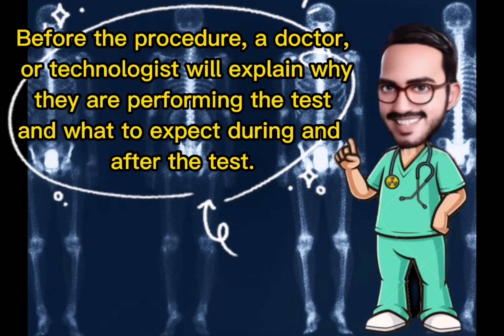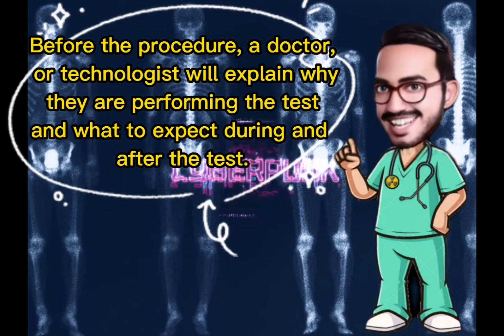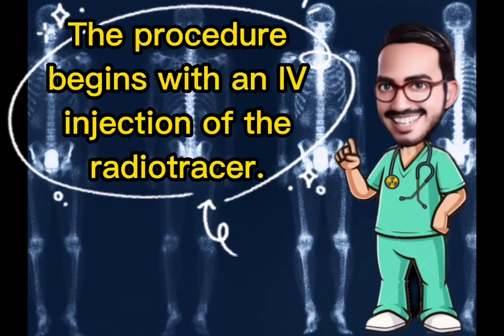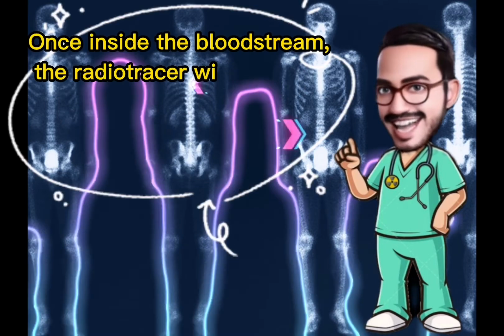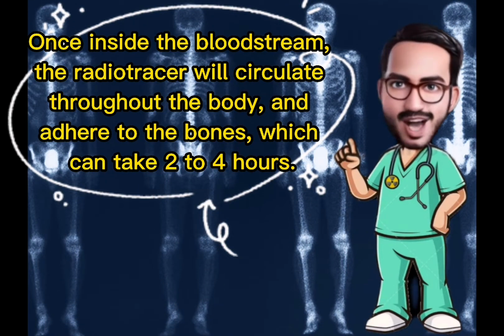Before the procedure, a doctor, nurse, or technologist will explain why they are performing the test and what to expect during and after the test. The procedure begins with an IV injection of the radiotracer. Once inside the bloodstream, the radiotracer will circulate throughout the body and adhere to the bones, which can take 2 to 4 hours.